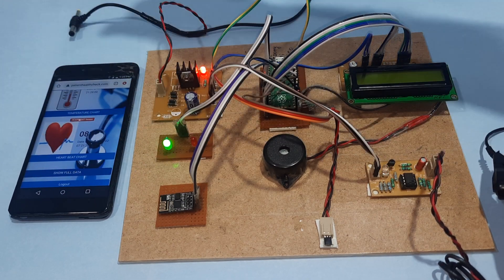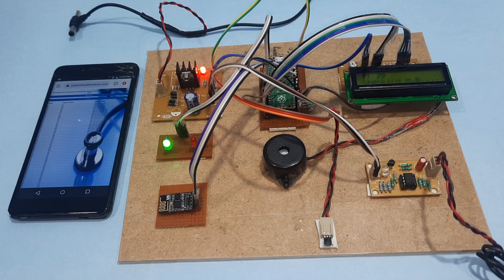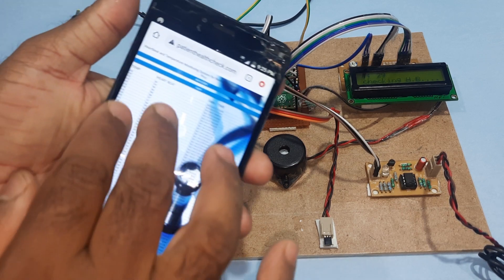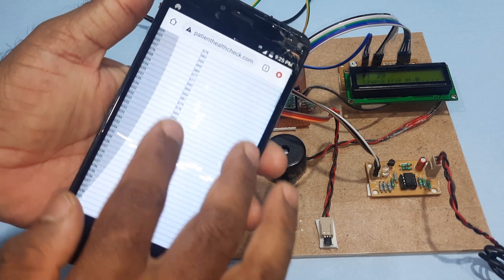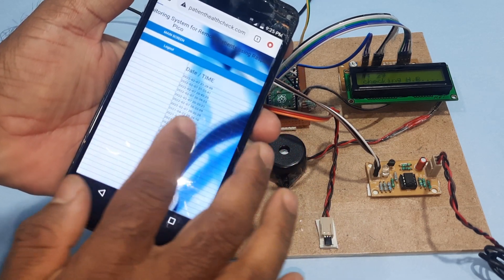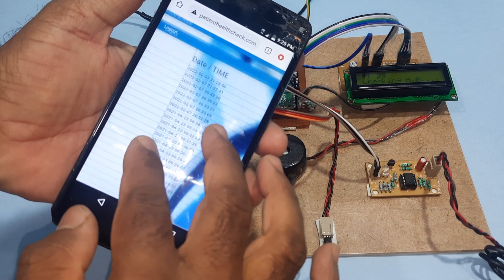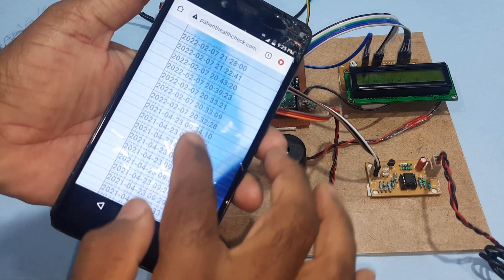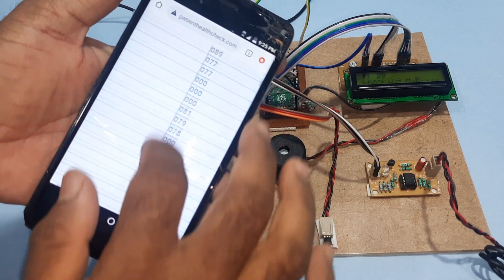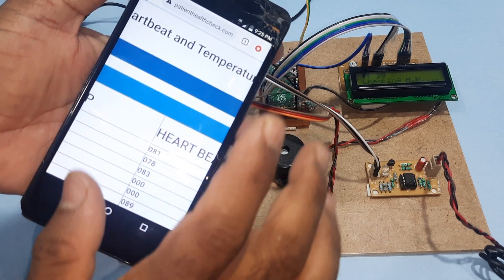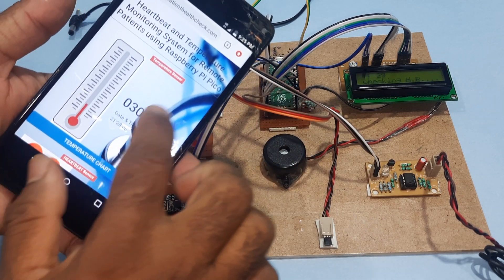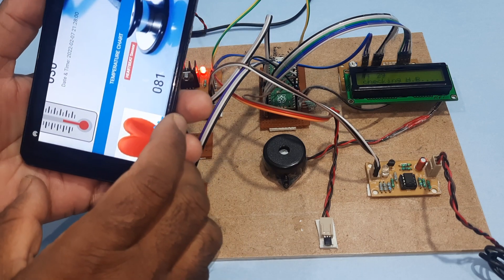You can see the full data on the website, including temperature, heartbeat, date, and time. The main dashboard shows the temperature parameter and heartbeat value.